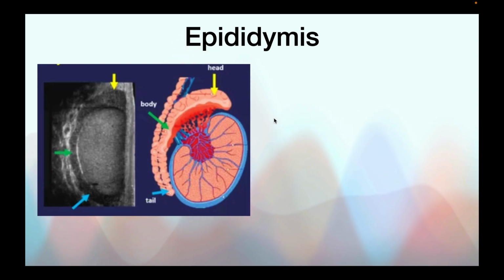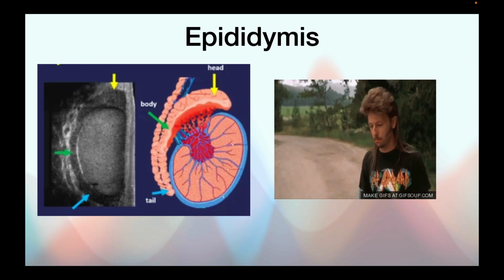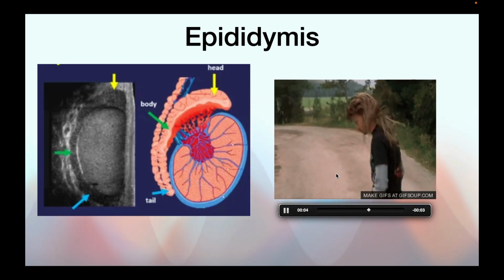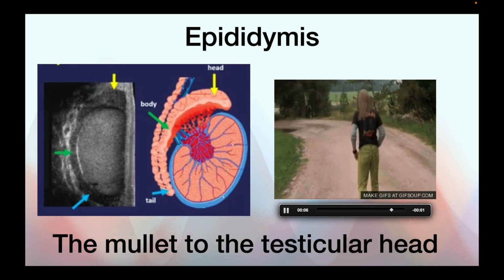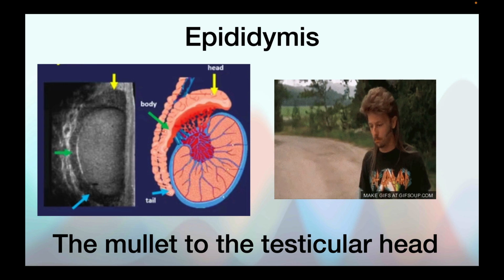Now, it sits on top of the testicle, and behind it, and it kind of reminds me of a hairstyle. Yeah, that's it. It's short on top and long in the back. That's right, it's the mullet to the testicular head. You'll never forget where the epididymis is now.